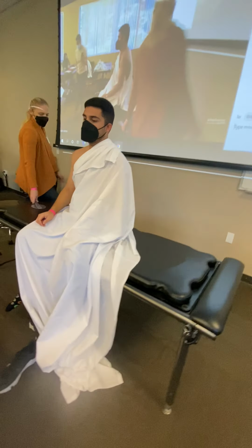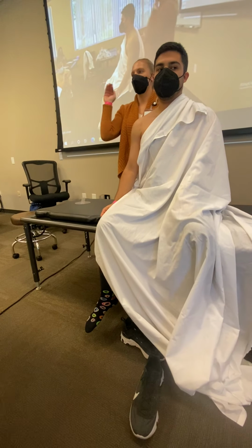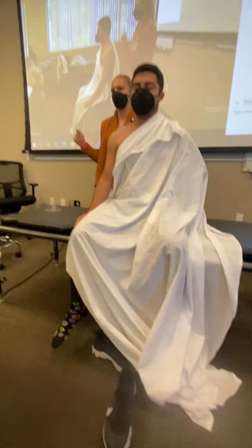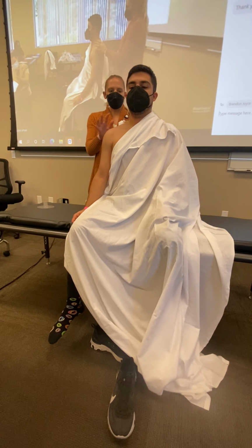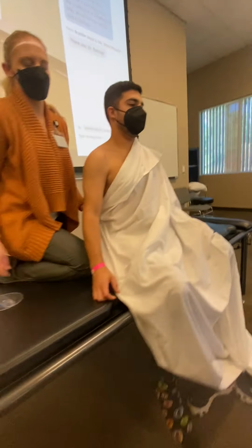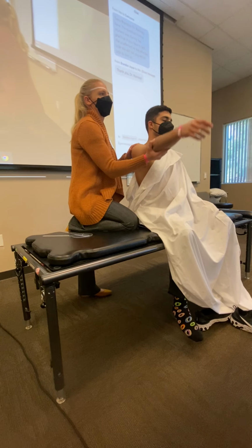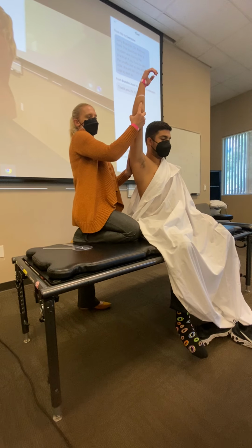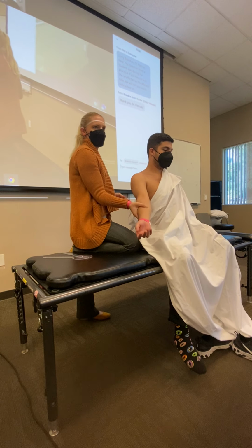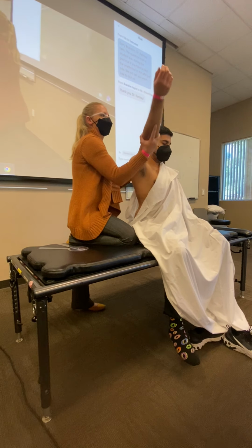Patient sitting with the high-low tables. I can't do this with this table, but again with the high-low tables, when your patient's sitting, make sure their feet are on the floor. That's one of the patient position points that you'll be getting on your practical. Patient sitting, having him sit up nice and tall. I would probably be standing in front of them, but you're going to have them come into full shoulder flexion. So we're doing triceps, full supination at the forearm, externally rotating, and then coming up into that full shoulder flexion.